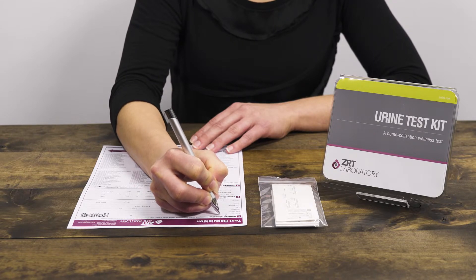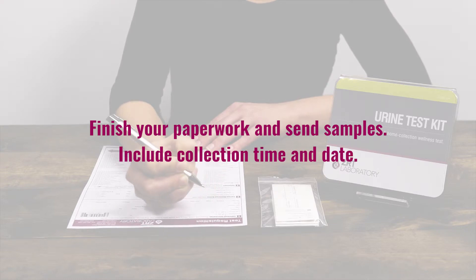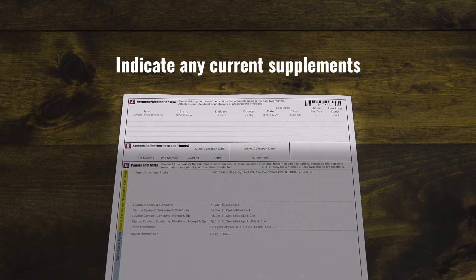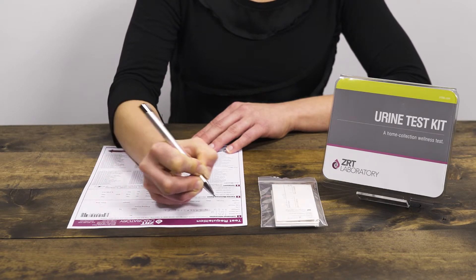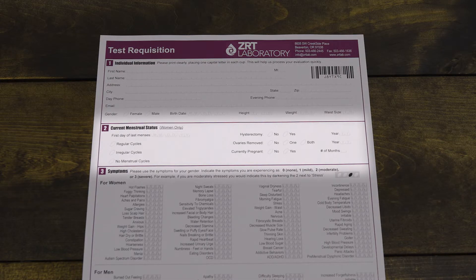Finally, you'll need to complete all sections of the test requisition and sign your form. Be sure to include the collection time and date. It is important to indicate any current hormones or supplements on your requisition form. If you are unsure of the dosage, please consult with your physician or pharmacist. Pre-menopausal women, please remember to include the first day of your last menses in section 2.